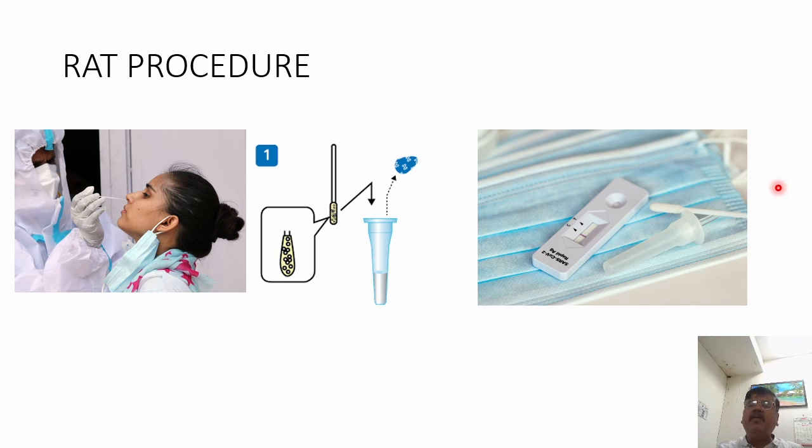So, what is the guideline given by ICMR? Simultaneously, you collect both specimens. That is, the rapid antigen test as well as the RT-PCR specimens should be collected simultaneously. If RAT is positive, discard the RT-PCR sample, because positive is compulsorily positive, confirmed positive. If it is negative, we have to process the RT-PCR. So simultaneously both samples are taken for RAT as well as RT-PCR.